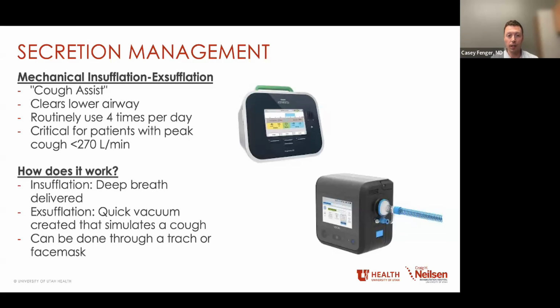The way it works is it gives a deep breath, expands the lungs, and then quickly creates a vacuum to pull all the air out, which is like simulating a cough. For every session, you do a handful of cycles to get those secretions out. And this can be done through a trach and/or a face mask.